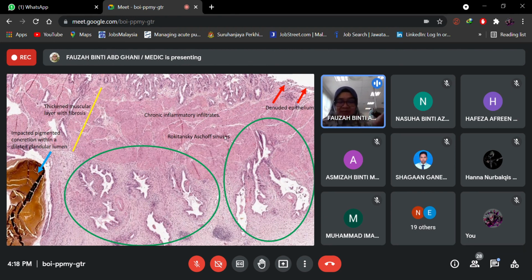So we thought, oh, is this malignancy, is this invasion? But not in this case. Special in this case, the presence of these glands deeper in the structure, like in the muscularis propria and in the subserosa, is not because of invasion, but because of the chronic process. These glands actually become enlarged and burrow deeper and deeper and deeper.